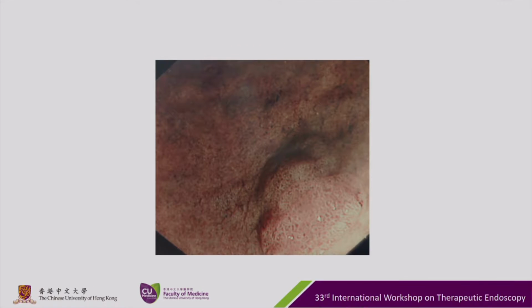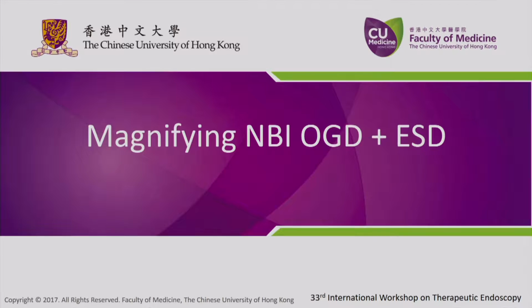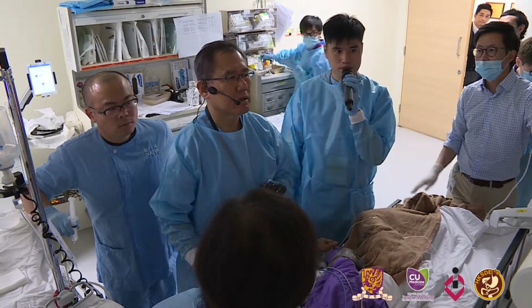So here we have the endoscopic images. And today we'll be performing a magnifying narrowband imaging OGD and endoscopic submucosal dissection. Yeah, so I'm here with Professor Yao.